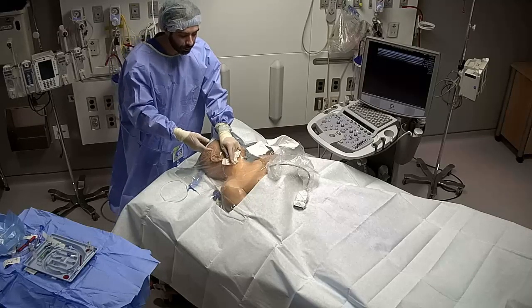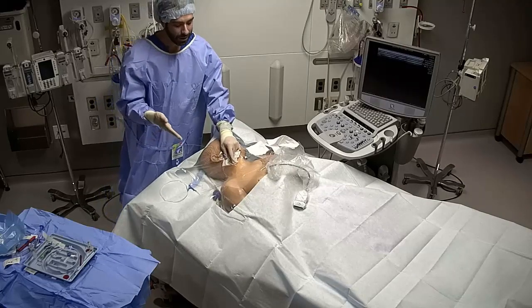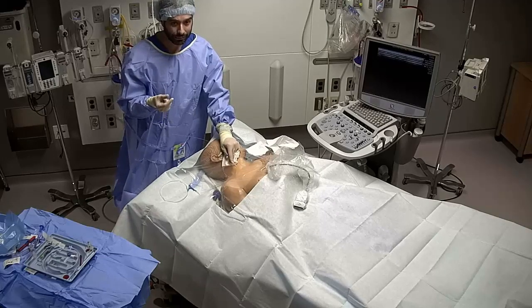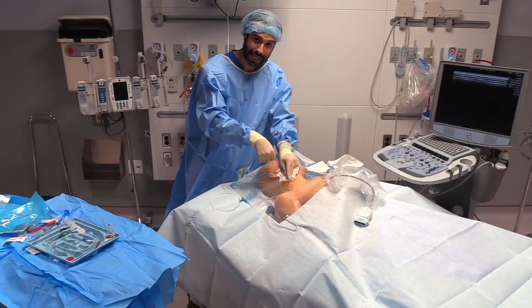With a triple lumen, this is a flimsy catheter. It's unlikely to perforate the posterior wall of the vessel. But in case you're using a big 14 French catheter, or you're going into a very stiff artery and using a stiff wire, for somebody who's getting a balloon pump placed or something else, you want to make sure that the wire does not kink underneath the skin.